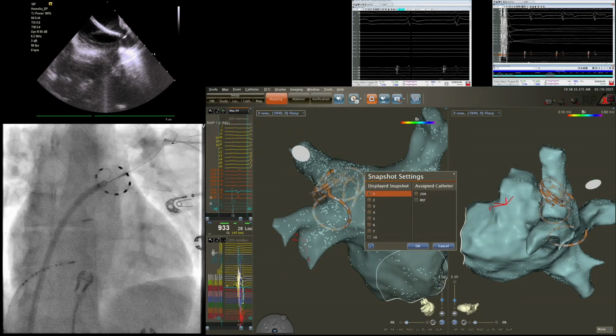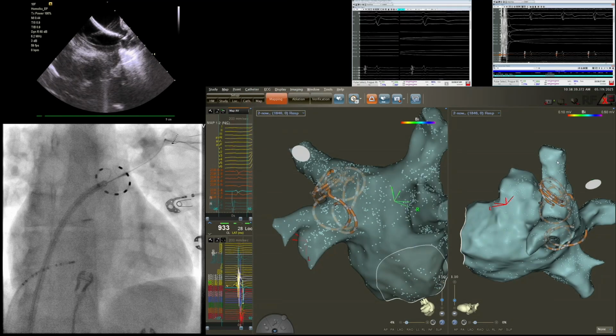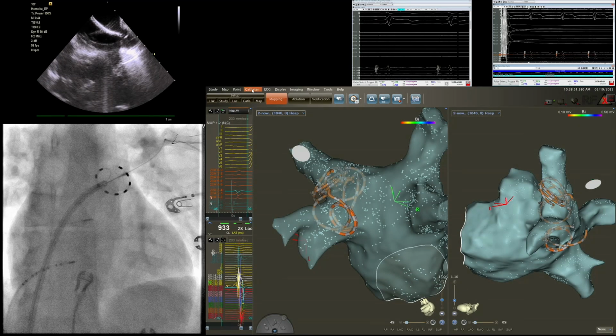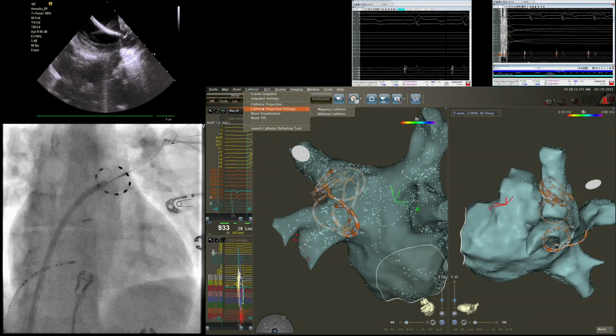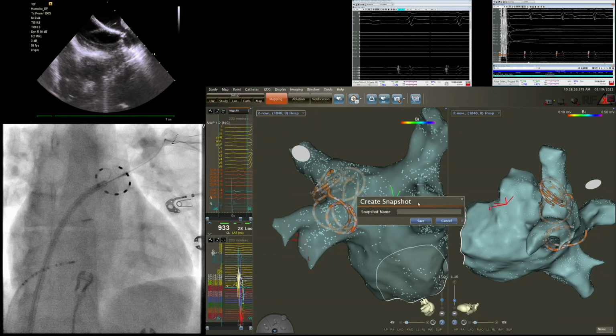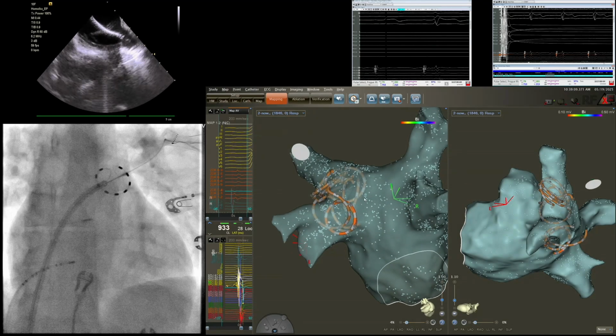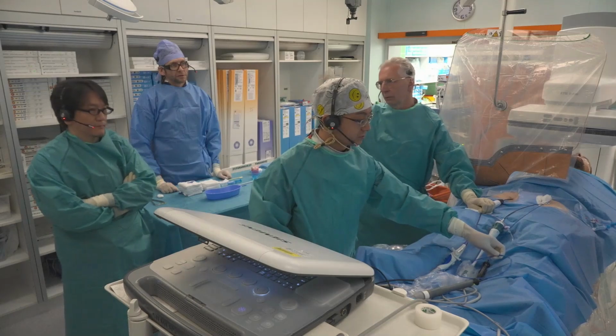You can appreciate no signals, but still, I don't care about no signals, okay? I really want to cover the field. So we will finish these events, and then we will move to the right. We'll show you the right super. But at the end of the live session, we would really like to show you the map and the anchoring principle. We can come back to you at the end. Okay, let's continue.